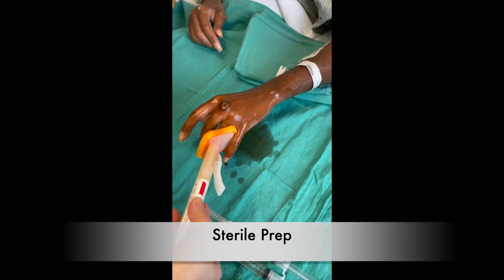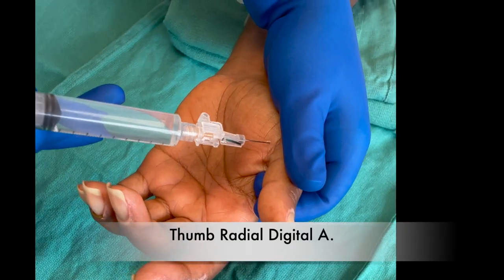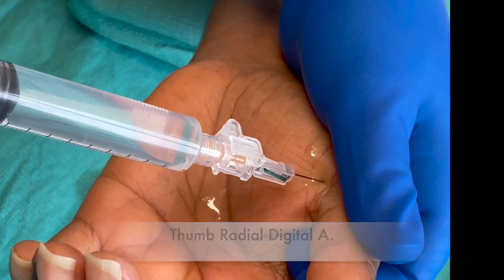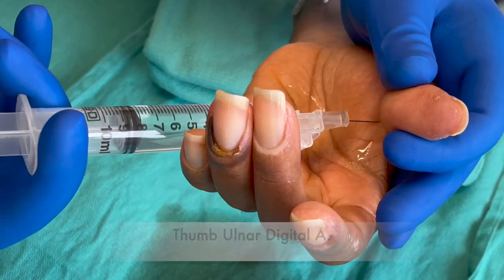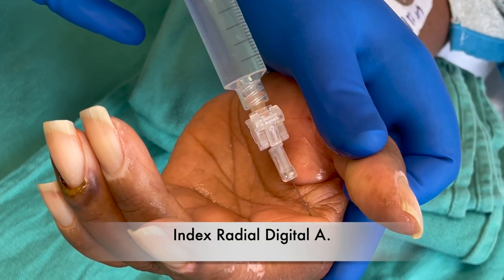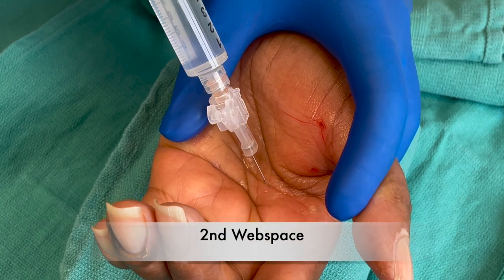After sterile prep, we begin by injecting the thumb and progress ulnarly across the palm. However, the particular injection order does not matter. Web space injections are given proximal to the A1 pulley. Penetrate deep to the palmar fascia before injecting to ensure the botulinum reaches the arteries.